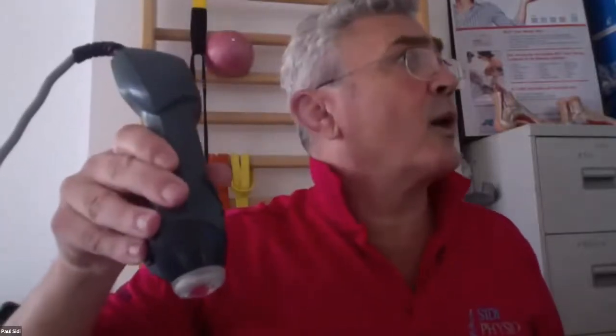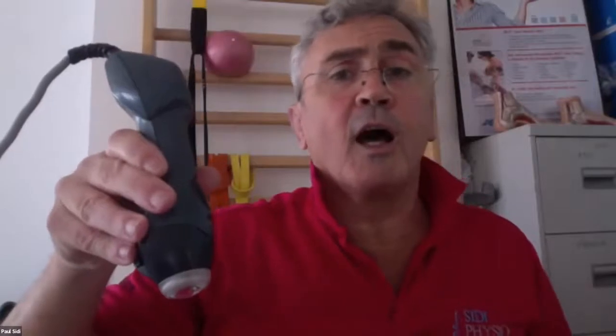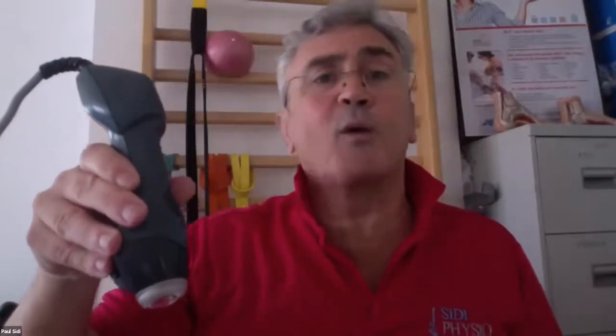And I say to people, you could be on with that K laser, and you have to keep it moving. You can't keep it still. You have to keep it moving all the time. If somebody walks in the room and you stop, and you stop moving it, then you turn around, smoke will be coming out of them. They'll be screaming, and it's not very good.